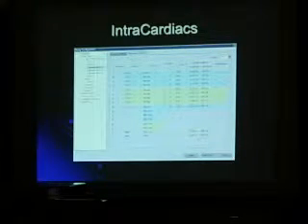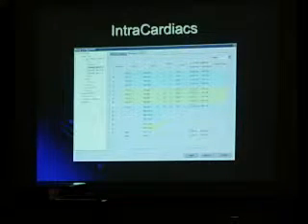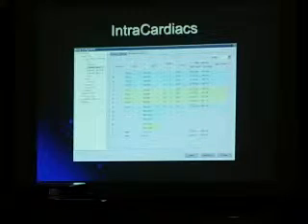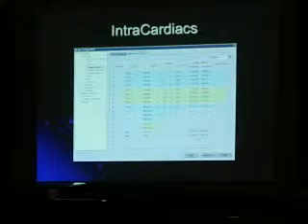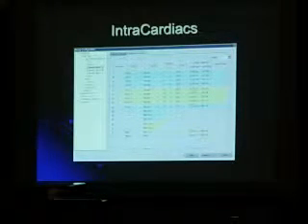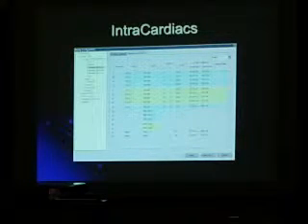All electronic interference is usually based off of a harmonic from your 60 hertz cycle. You guys understand what a harmonic is? All you do is just double the number, and that's the next one. Musical reference. So it's all a harmonic. A lot of our noise is coming in at 120 hertz, 180 hertz, 240 hertz. 240 hertz is a big number for computers.